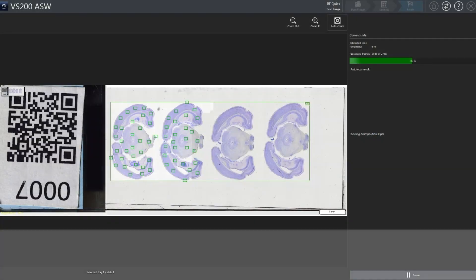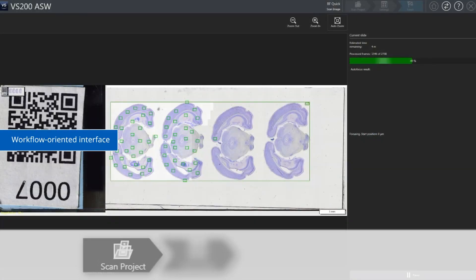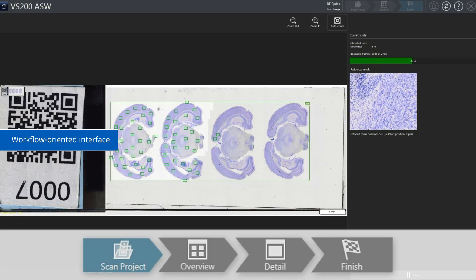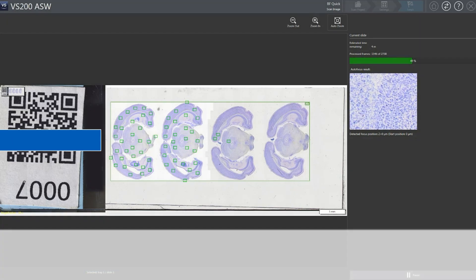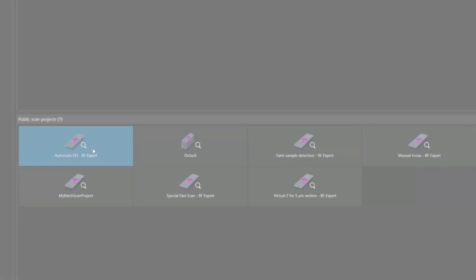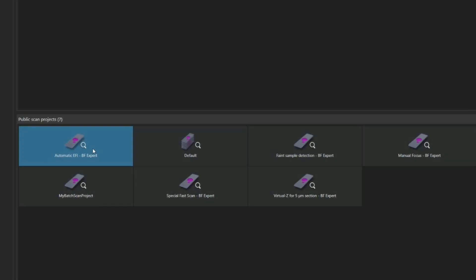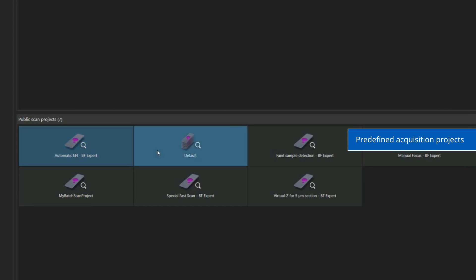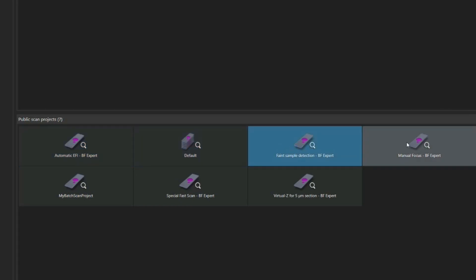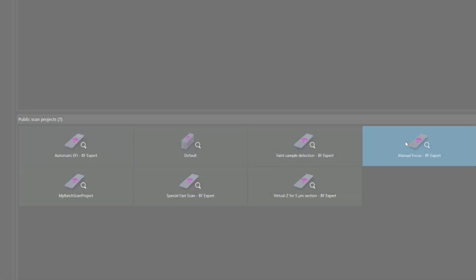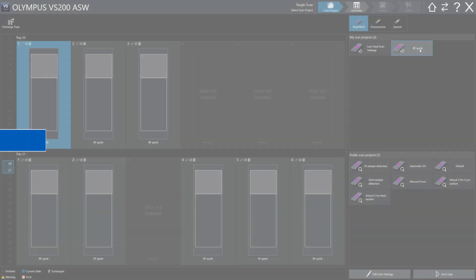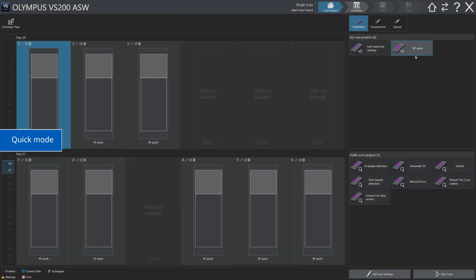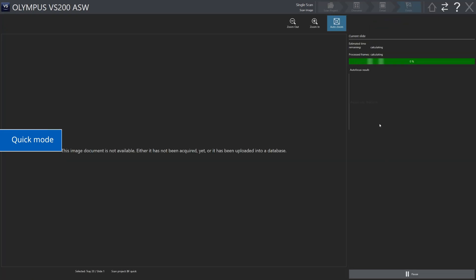The VS-200 system offers a simple workflow-oriented interface that makes setting up scans fast and efficient. For repetitive workflows, save and recall your predefined acquisition setting projects. And with Quick Mode, you can start scanning in as few as two clicks.